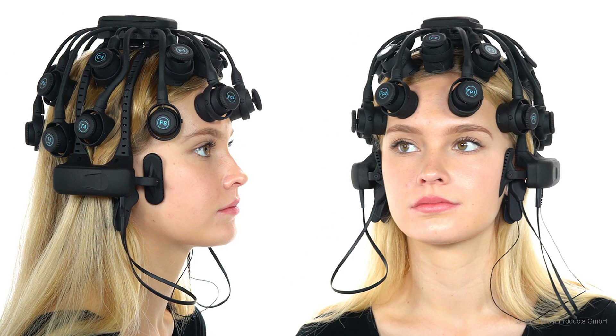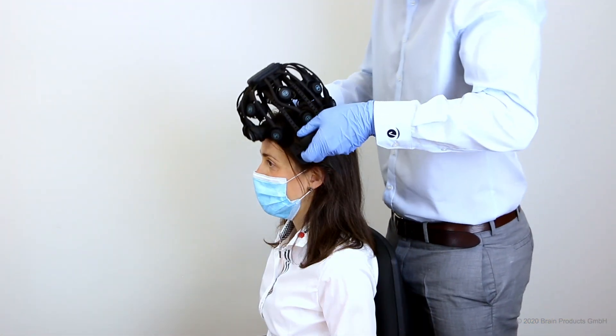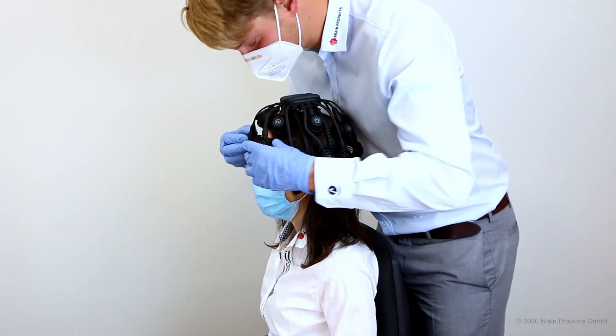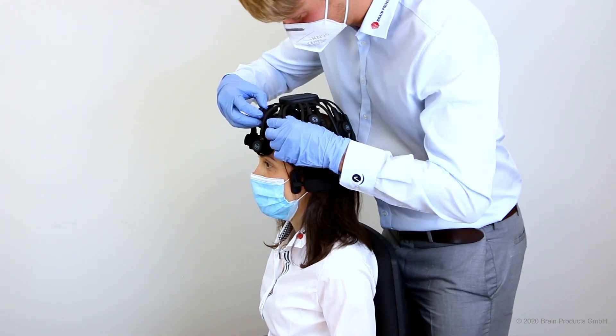Wearing the headset is easy and can be self-done with little fuss. Just grab the sides, pull down onto the head of the participant, and then ensure that all sensors have a good connection with the scalp.